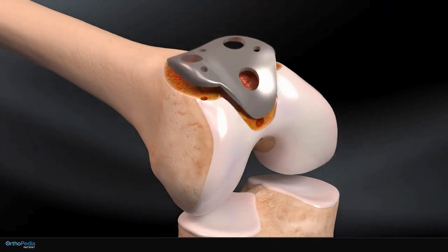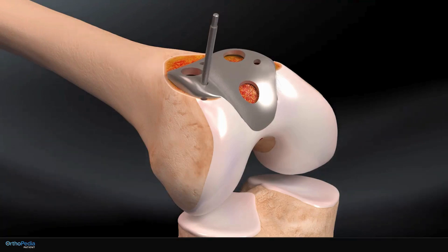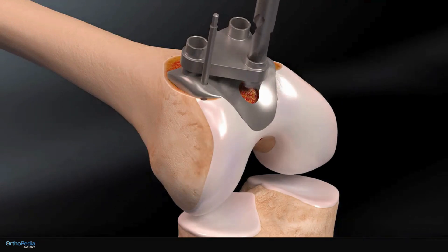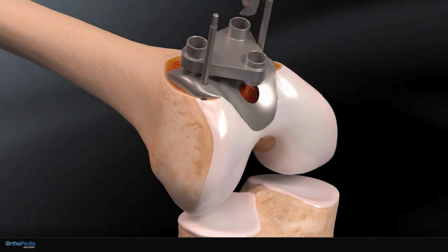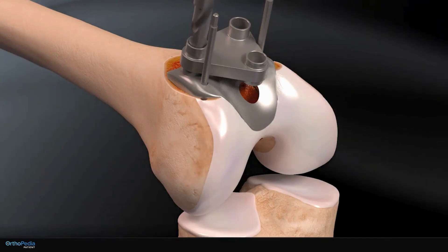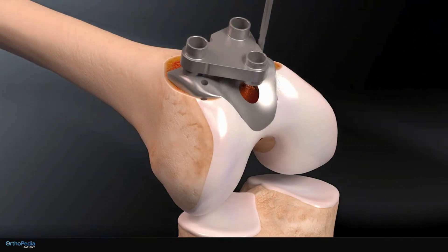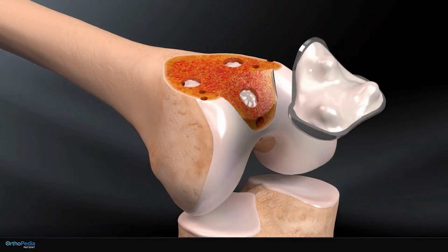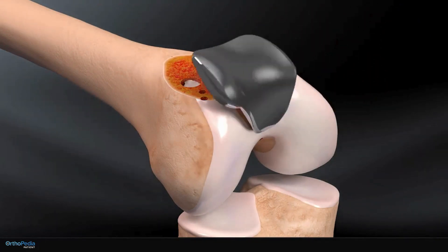A trial implant is placed on top of the thigh bone and held in place with metal pins. Three holes are then drilled into the thigh bone through the implant. The pins and trial implant are removed and a final metal implant, coated with bone cement, is placed on top of the bone.